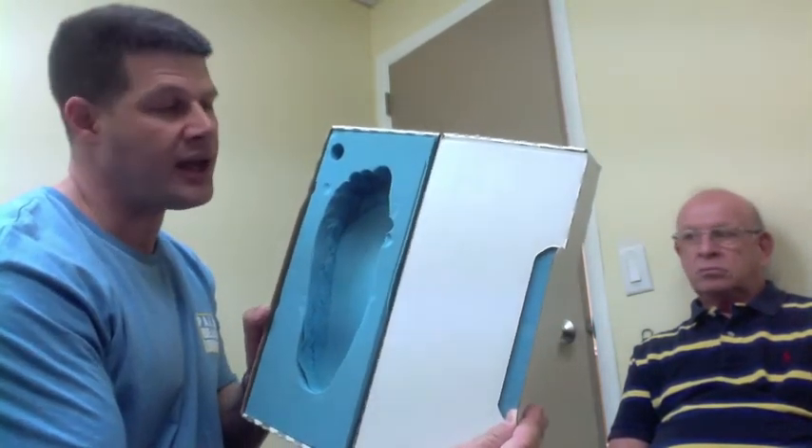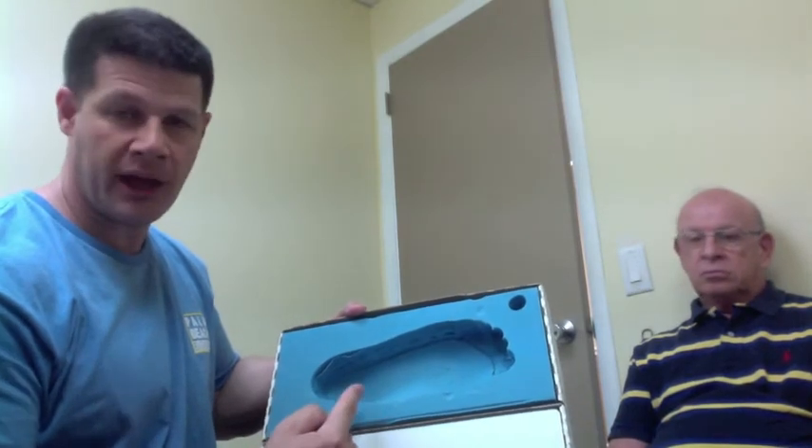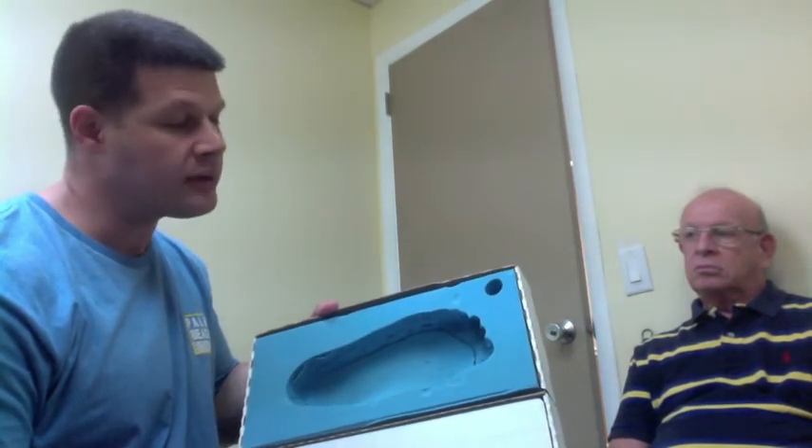Here's what the impression looks like — you can see how deep it is. Once the laboratory receives this, they pour plaster of Paris into the mold. Once it hardens, which takes about 24 to 48 hours, this material is broken off and only the plaster of Paris impression remains. They take a very fine grit of sandpaper, smooth out any imperfections, and have an exact impression of your foot, which is used to make the orthotic material. Good luck — if you have any problems, give me a call and we can always make a follow-up video.